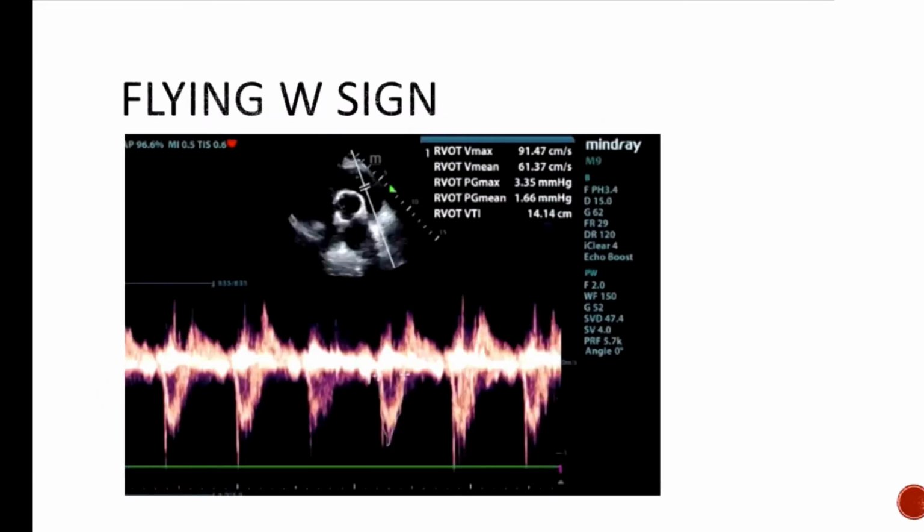So here's another image of the same thing that we're looking at. And up top of the screen here, we can see that view that we're talking about. So we see our aortic valve, our tricuspid valve. This is our right ventricular outflow tract here. And this is our pulmonic valve. Okay, and that's the image that we're looking at. Again, PAT less than 105 or notching, right? Those are two big signs that you'll see.